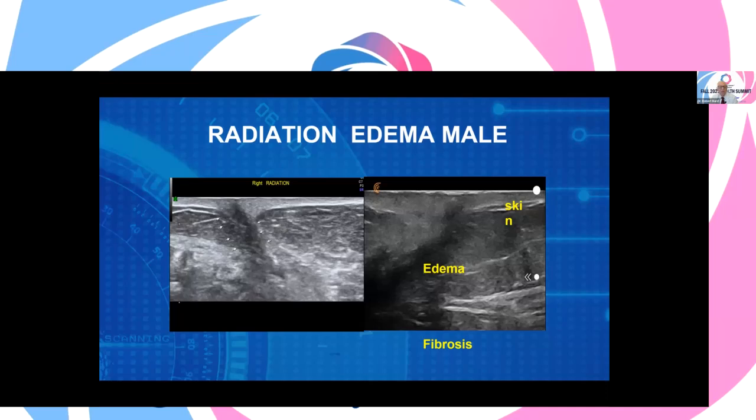And let me point out that when the skin is irradiated, when the breast tissue is irradiated, it's hard. You can't do mammograms. Sonograms are hard, but the blood flow and the thermal technology are non-invasive, and they basically see cancers through the scar tissue if there is. Next, please.